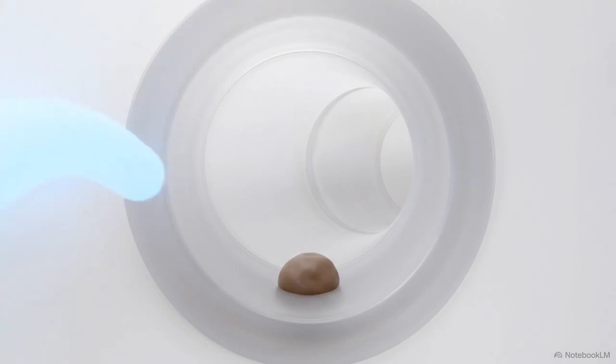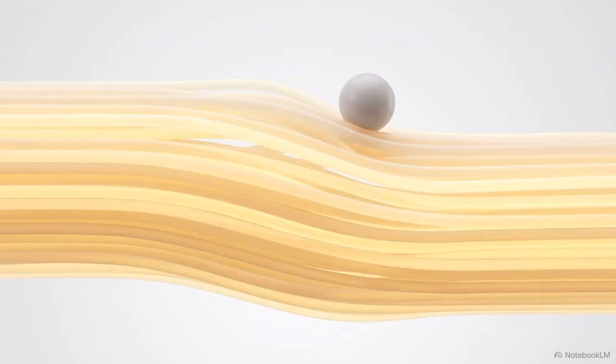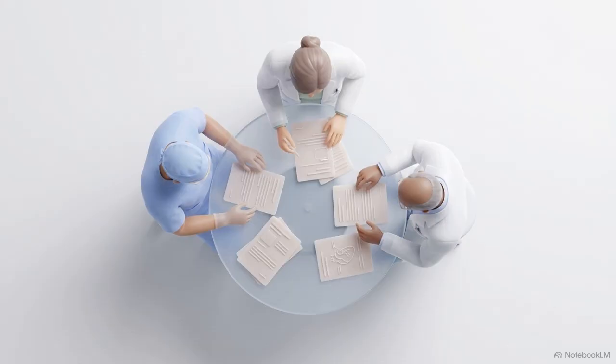However, this methodology has a known diagnostic limitation. The ABR misses roughly 30% of small acoustic tumors, measuring under 1.5 centimeters. This blind spot exists because of tonotopy. Small microtumors may not compress enough of the high-frequency basal nerve fibers to meaningfully delay the critical latency of wave V. When an ABR screen does detect a failure, it immediately triggers a multidisciplinary treatment pathway.